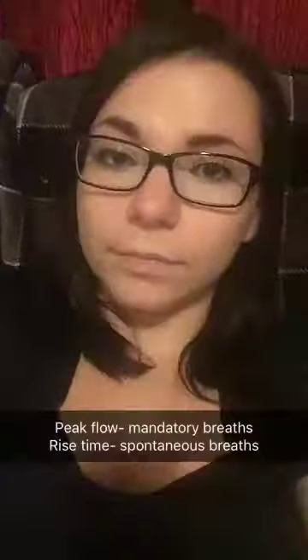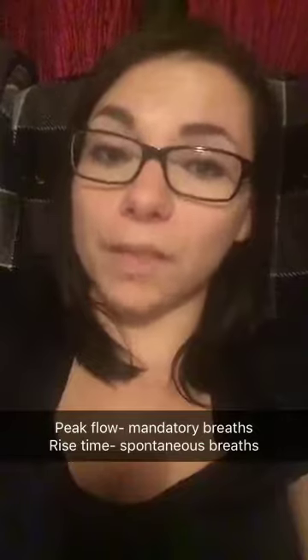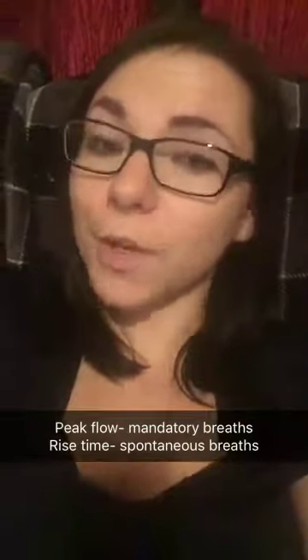So regardless of the breath type on a pressure by time scalar, a lag means your breath is being delivered too slowly and a spike means it's going too fast. Just remember to adjust the appropriate setting for each breath type. The flow for mandatory and the rise time for spontaneous. So that covers how you can use ventilator graphics to adjust some of your settings so they're most appropriate for your patient. Now let's look at some troubleshooting aspects of graphics.